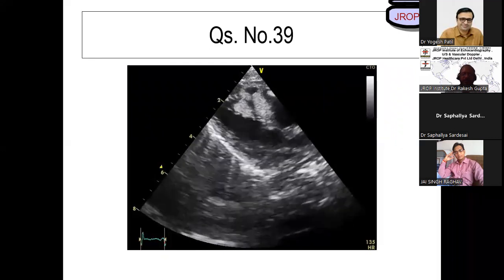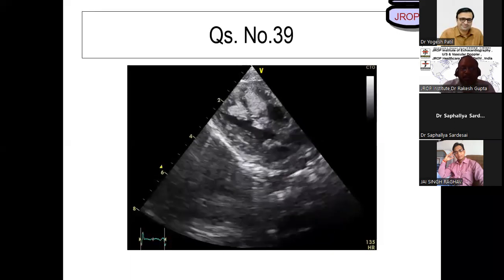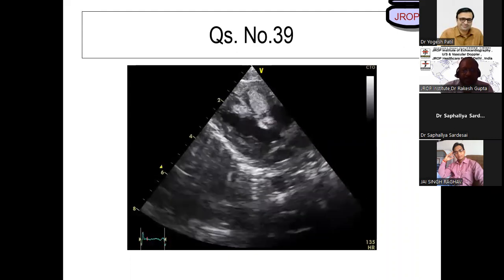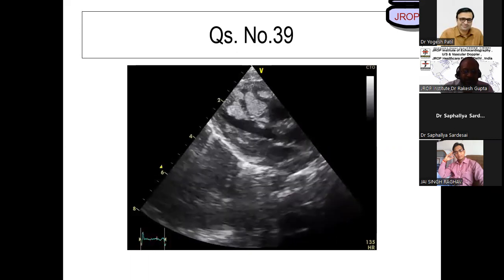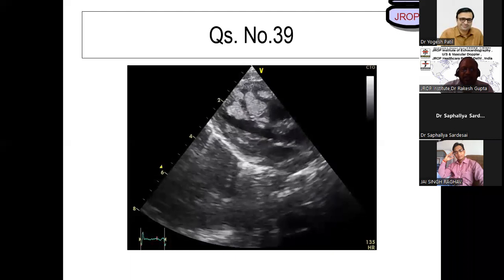Newborn. I'm trying to show you the best possible clips from my collection. These are not from one day. They are almost 25-30 years of collection.